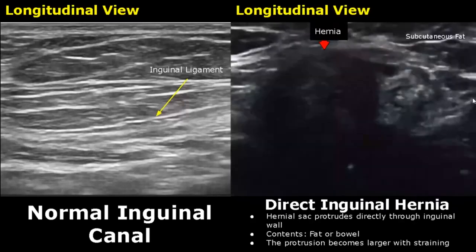The hernia will become more prominent with straining. Using Valsalva maneuver will provoke the hernia. The intra-abdominal pressure is increased with Valsalva maneuver, and this highlights the hernia. A hernia occurs due to increased intra-abdominal pressure caused by conditions such as weightlifting, chronic constipation, and obesity.